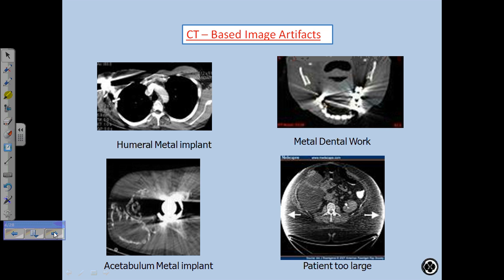And then this is also something that we see sometimes that you've got to be aware of. If the patient's too large for the scanner, this typically occurs for diagnostic scanners mostly, not really radiation oncology scanners, because our radiation oncology scanner bore is pretty big. So it doesn't occur often, but it can still occur for patients really out there.